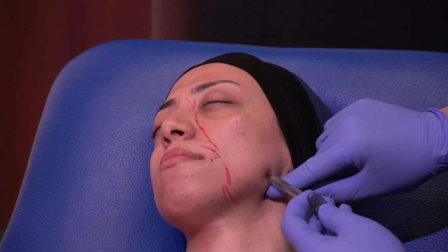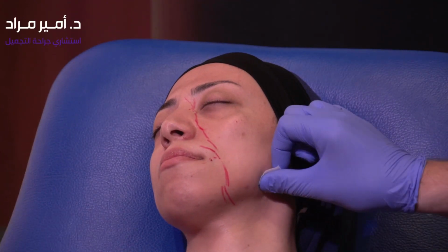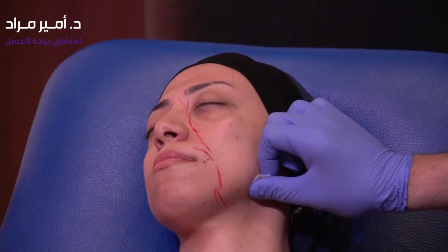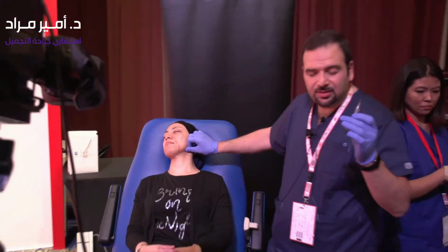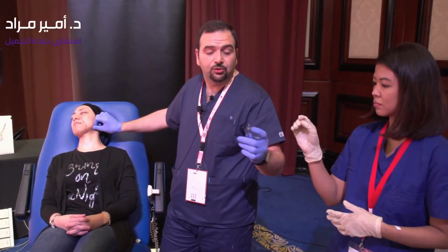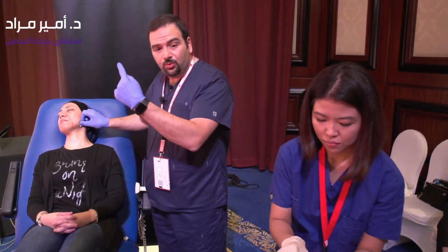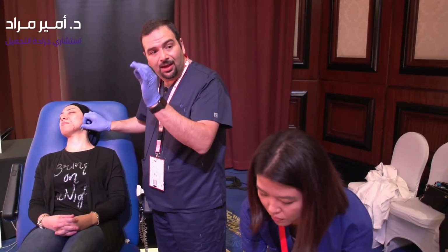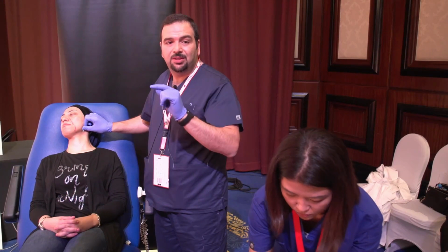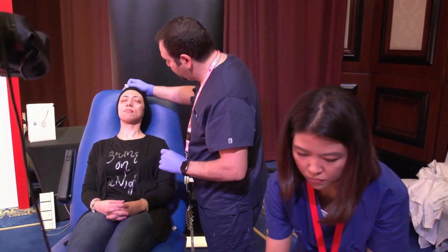Okay? An important point to talk about is that these needles are very fine needles, right? And if you hit the bone with them, you might blunt the needle. So if you're using the same needle on both sides, I might ask the nurse to change the needle. This is done now, so we don't need to change anything. But if you're going with half an injection on each side, I would change the needle if you're hitting the bone. Because if you go through the skin again with that same needle, the patient will feel pain.